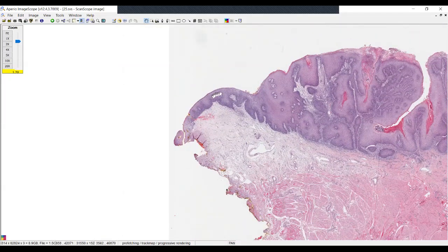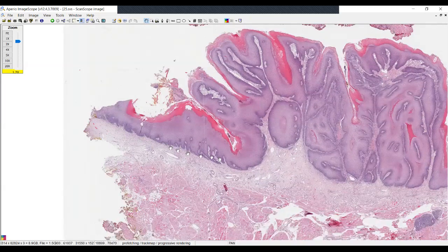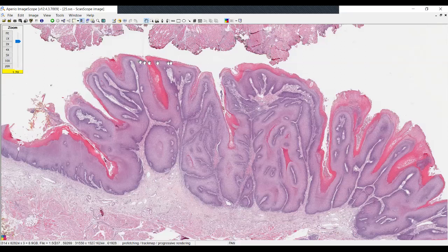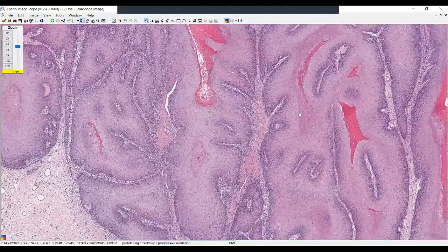I think if you look at this as a part of normal, and again over here, this has some abnormality with the area of parakeratinized material and increased parakeratosis. But again, this is well within a normal range in comparison to what you see with this remarkable proliferation here. It is interesting that it is quite blunted as an overall surface, even though it has these areas that expand downward in an endophytic pattern. There is parakeratosis present here, not really well-developed parakeratotic crypting.